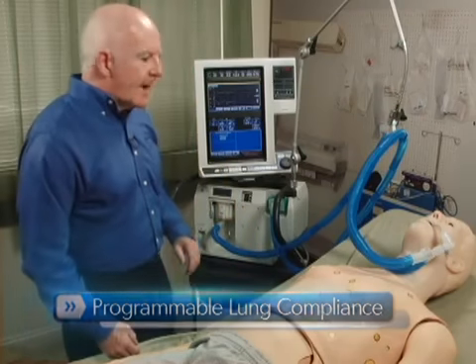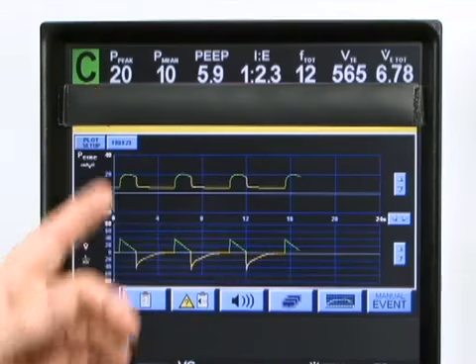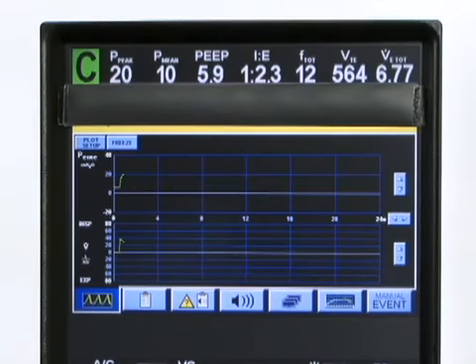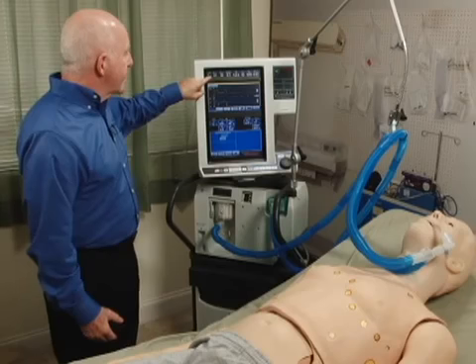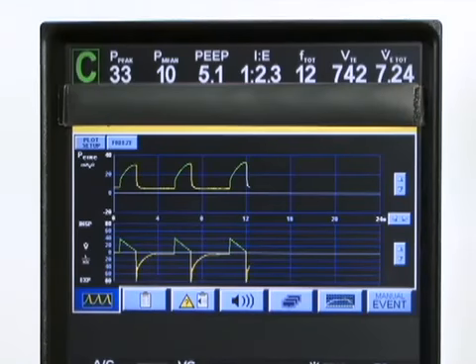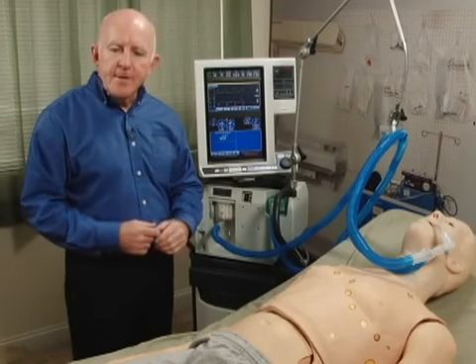We presently see HAL on a setting of PEEP of 5, peak pressures of 20, with a set tidal volume and assist control mode of 550. Now, if we make the compliance very low or make the system very stiff, we'll notice an increase in the relative parameters, a peak pressure of 31, 33. All this is being done while the mannequin is still operating in full scenario mode.